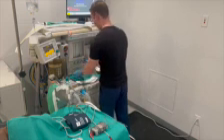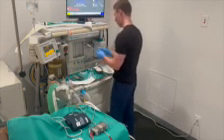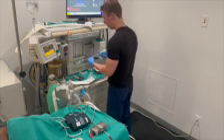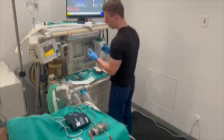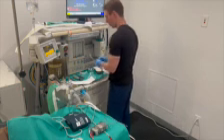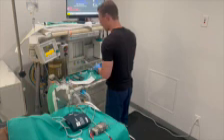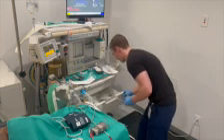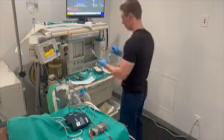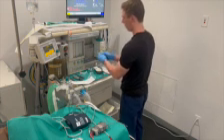Next, we will need an endotracheal tube. Tube selection will depend on the size of the patient, but most commonly, you will be selecting a 7, 7.5, or 8. After we have our tube selected, we must make sure that the balloon at the distal end holds air. Once balloon integrity is confirmed, deflate the balloon and make sure that you have the 10 ml syringe close by the tube so that you can use it to inflate later. Next, inserting an intubating stylet will add rigidity to the endotracheal tube and make it easier to aim once in the airway. A common preference among providers is shaping the tube into a hockey stick shape so that the distal end can be aimed up if the airway ends up being slightly anterior.